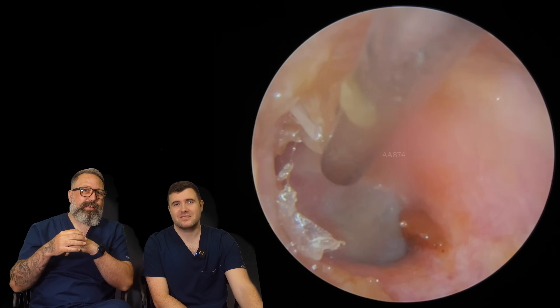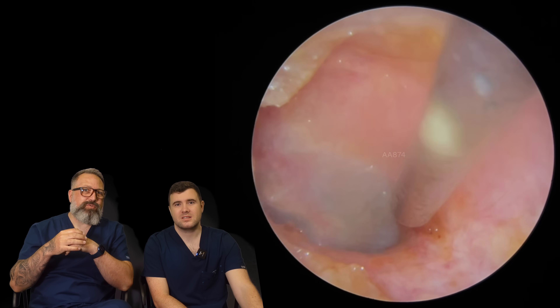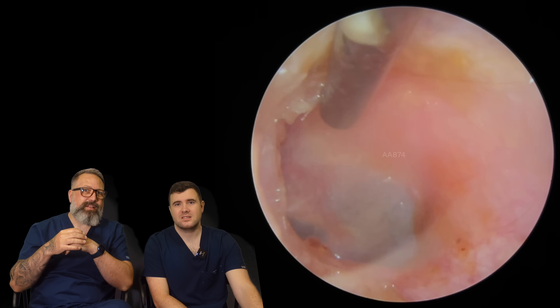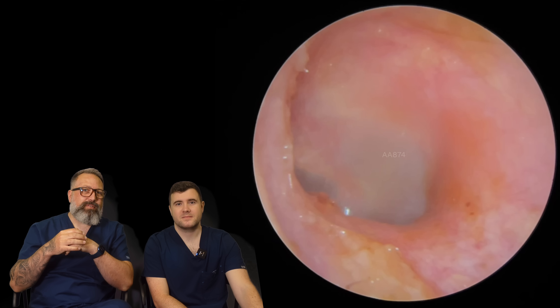But no, that's looking good. Oh, here we go, it's coming away. I'm just getting some of that drier keratin material, a little bit of wax. There you go. Out that comes. Perfect. There we go, looking lovely.